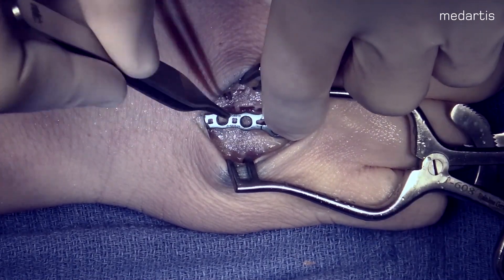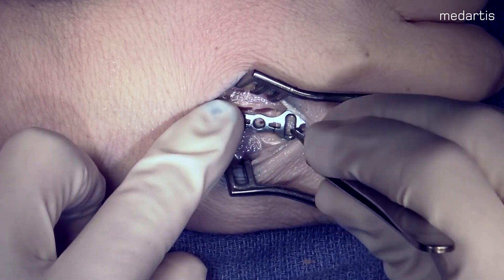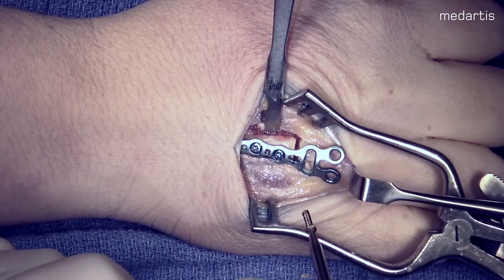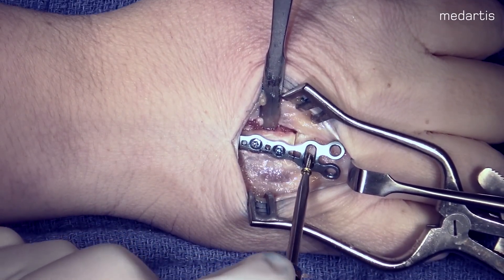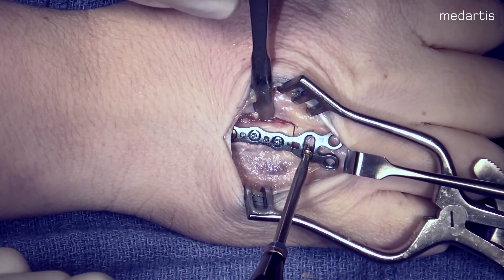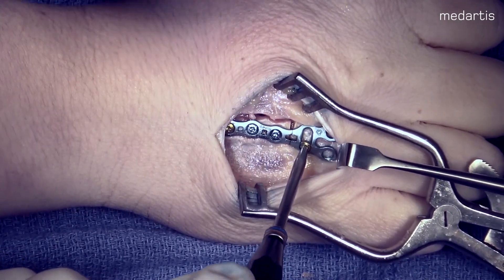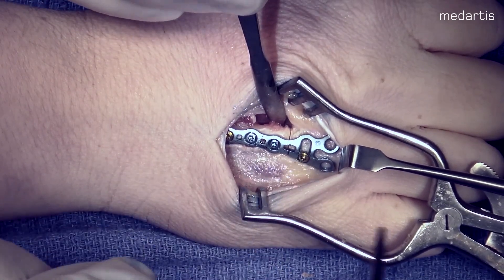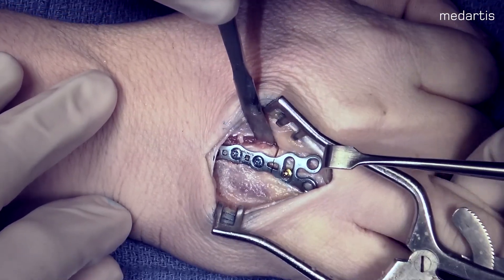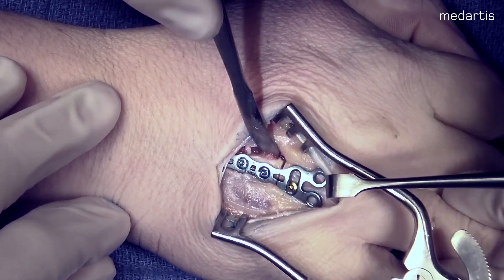Now we're going to place our plate back in the previous location, guided by the pre-drilled and pre-placed screws. As you replace the cortical screw in your correction oblong hole, it is important not to make it too tight, otherwise you will not be able to achieve the appropriate correction. Depending on the position in the oblong hole, you can achieve a variable amount of correction as needed.